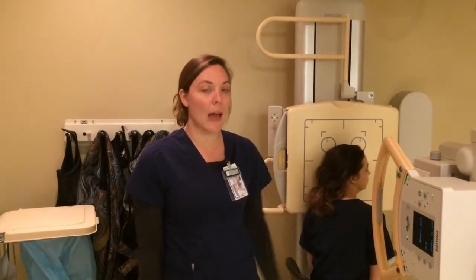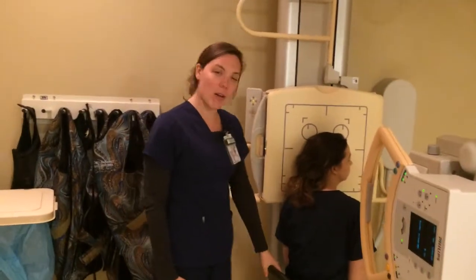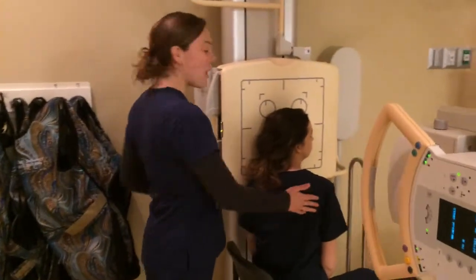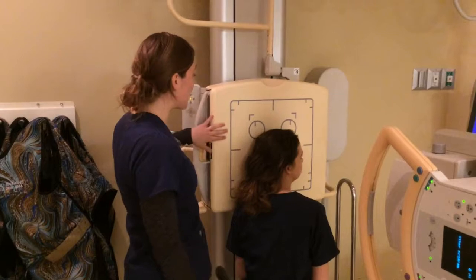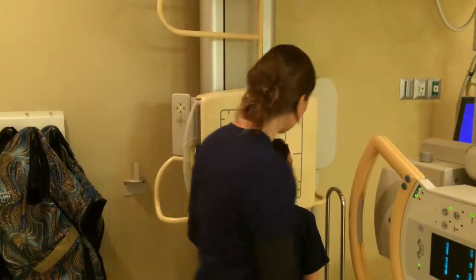All right, so the first projection we're going to be doing is the lateral. You can do a left or right lateral, however, I've chosen to do a left. So we've had our patient sit down on a chair in the LAO position. We're still using the 10 by 12 in a landscape position at 40 SID.